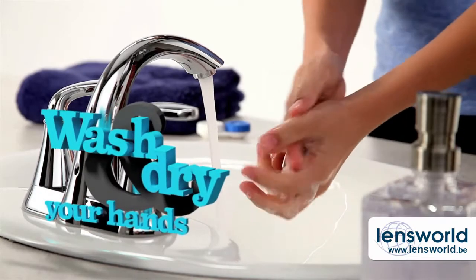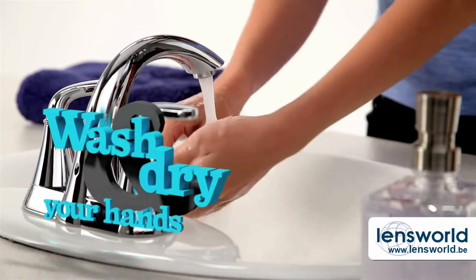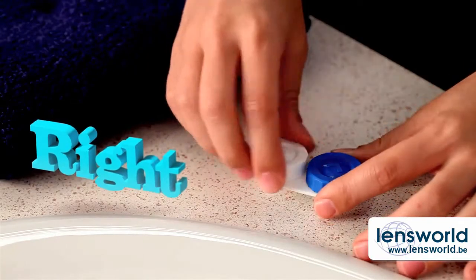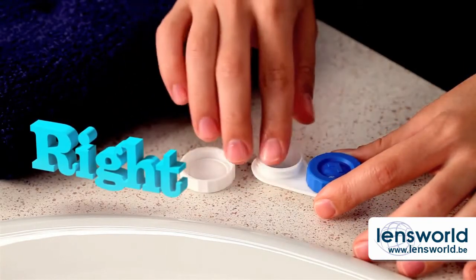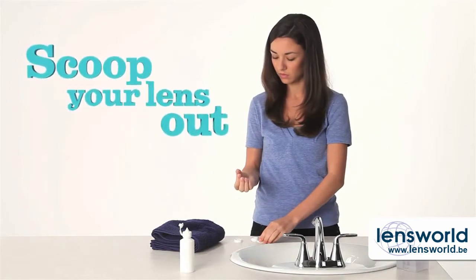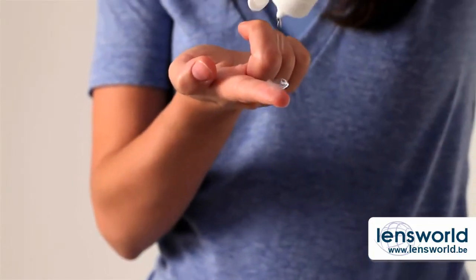Okay, let's get to it. First, always wash and dry your hands before you touch your lenses or your eyes — you definitely don't want dirt or germs on either. Always start with the lens for your right eye so you don't mix them up, since each eye has its own prescription. Scoop your lens out of the case, then follow the instructions for your lens solution.